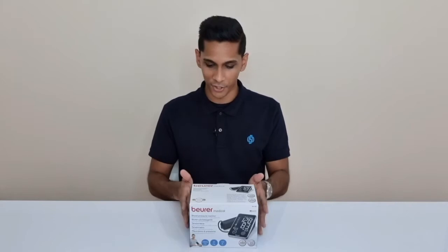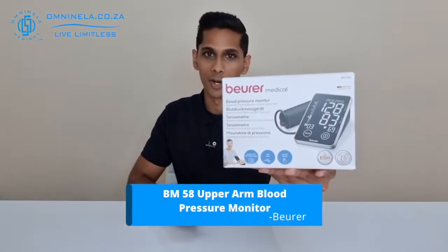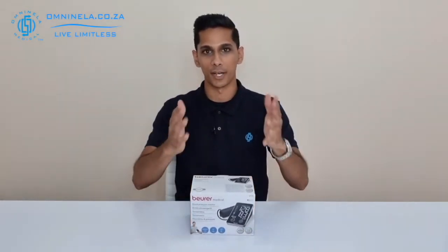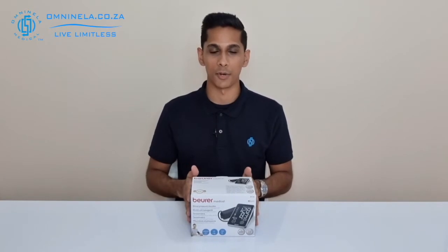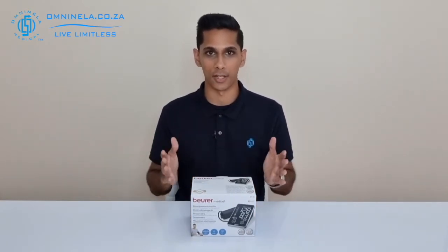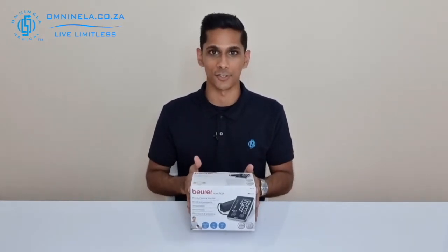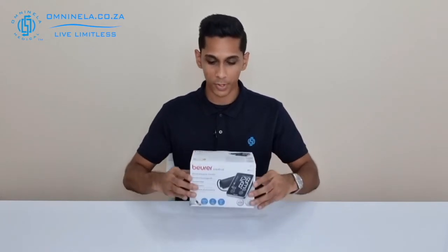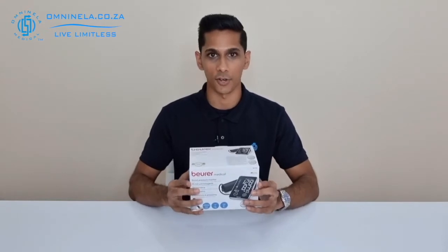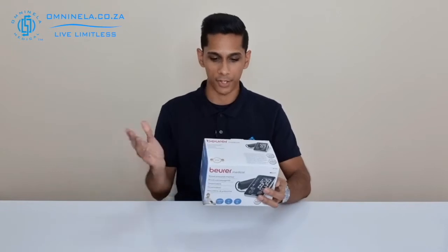Today we've got the BM 58 from Beurer, and this is one of their upper arm blood pressure monitors. If you have been recommended by your doctor to get a blood pressure monitor, or would just like to check and monitor your health from the comfort of your own home, then this would be a good entry-level device to get you going. In this video we'll unbox this and have a look at the features and items that come with this product.